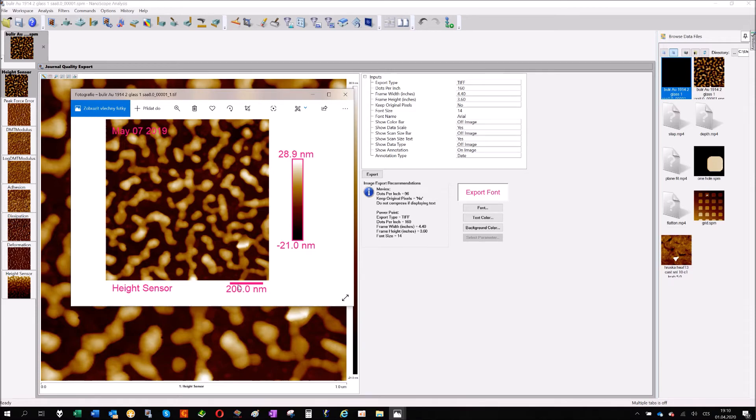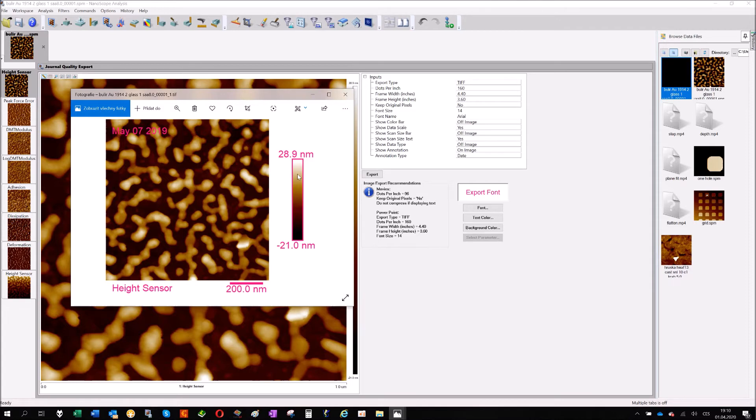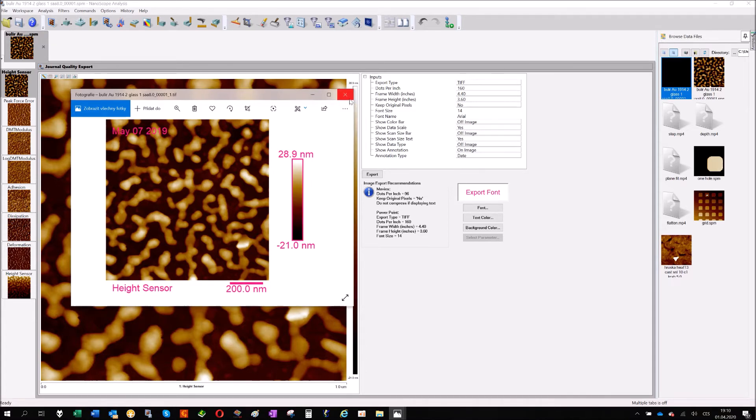Data file, that's the height sensor information. Scan size text, that's this one. Sidebar, this one, and this one is this one. So this is the export, but it's the export in 2D.